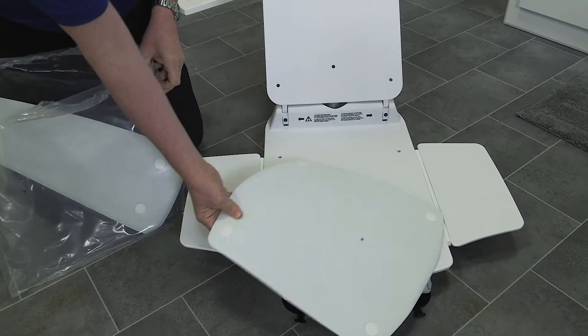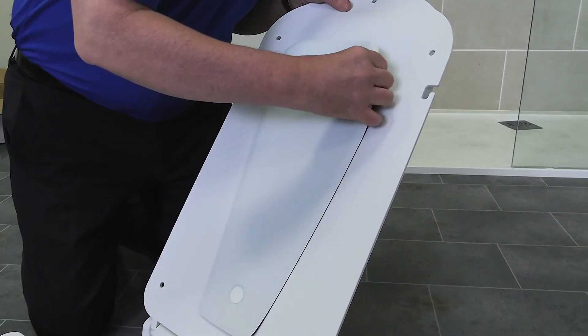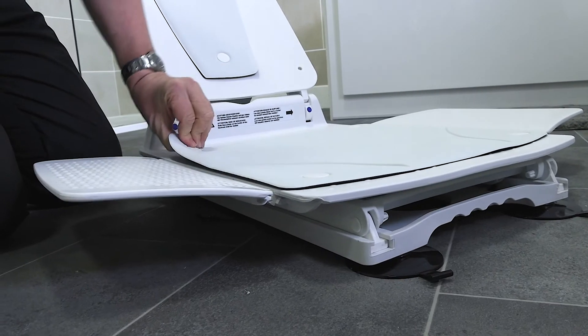Now you can add the padded covers. Simply place the covers in their correct position on the backrest and seat surface. Then press the attachment buttons into the designated holes.